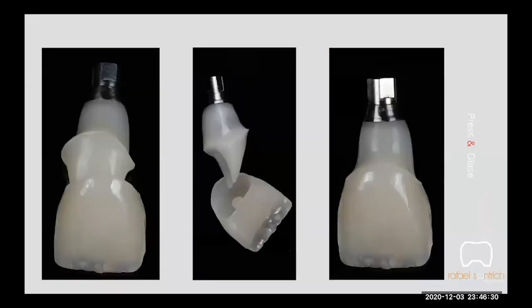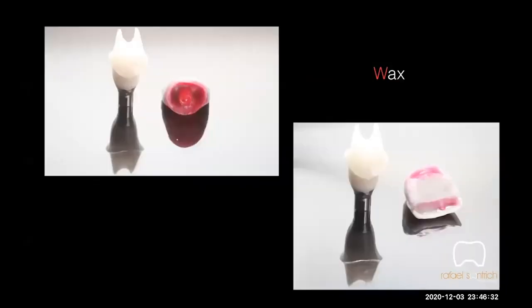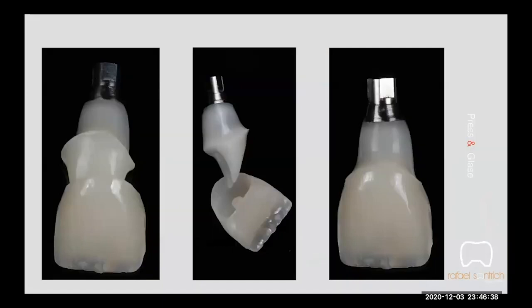We use the gray one to do the final contour, okay? And we seal the margin with the red one too. Then we press, and the fit is really, really good. So we can see the emergence profile of the abutment. We can see the fit of the crown. We can see all the characteristics that we place from palatal of the tooth.